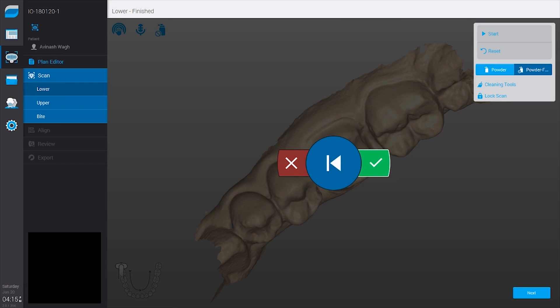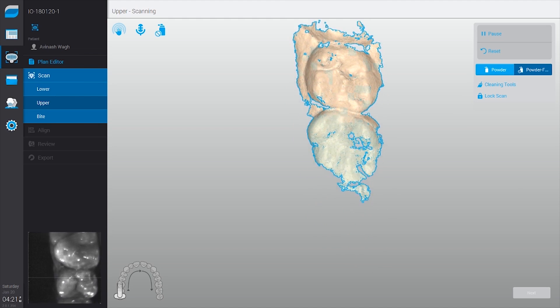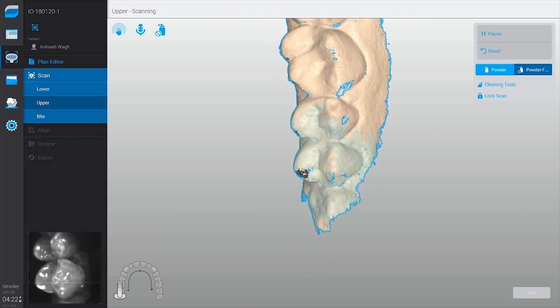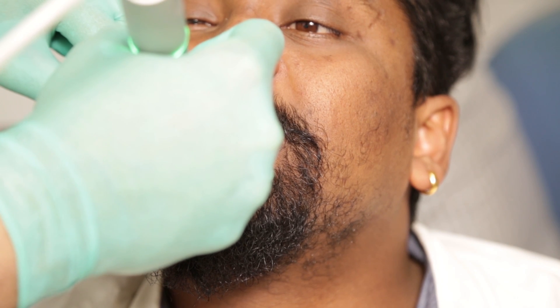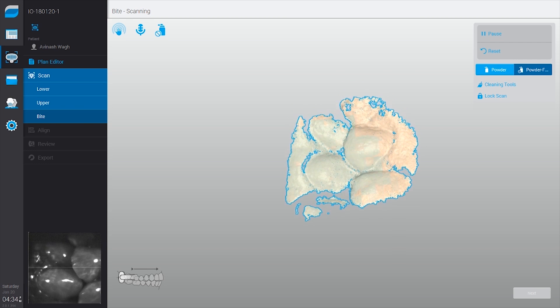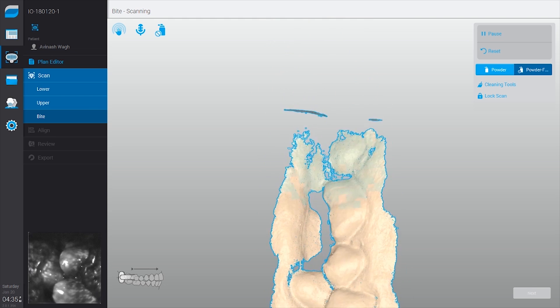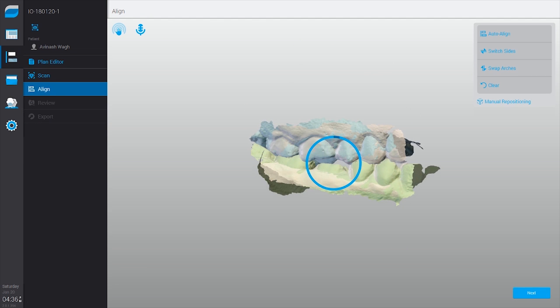I can also use voice commands to control the system. Similarly, I will complete the maxillary scan as well. As you can see, while I scan, the system is automatically reconstructing the 3D model of the patient's jaw. It's now time to take the buccal scan, which will help the software orient the upper and lower scans together. Once the scans are complete, I can easily send them to the lab within a few minutes.